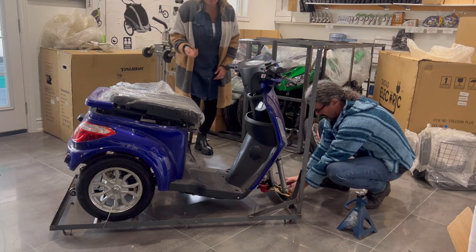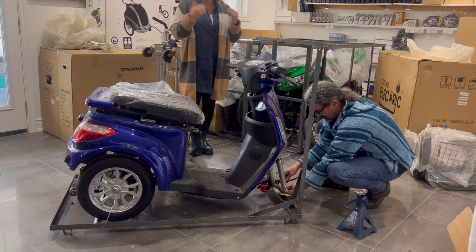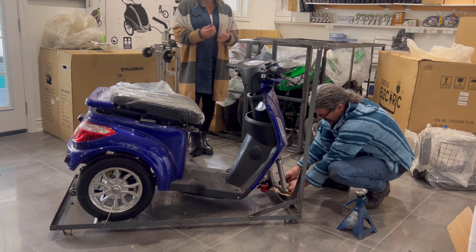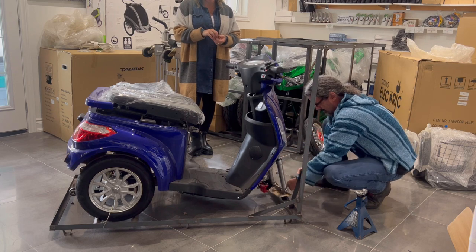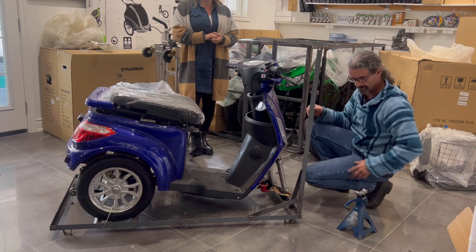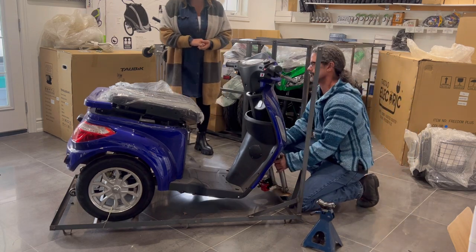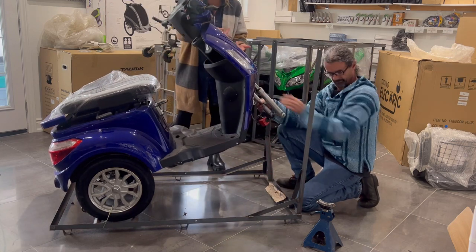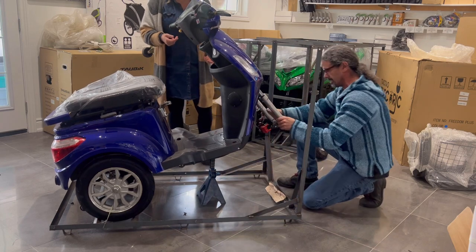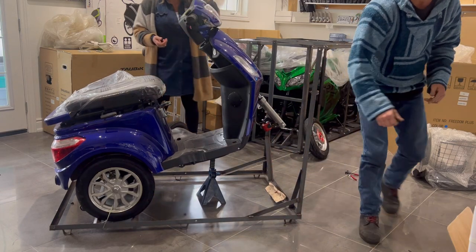This one is empty — this is how they come. If you order, we install the lithium or the lead acid battery and it ships to you with the batteries in, so you don't have to worry about that. The lead acid will have 60–75 pounds of battery in it. The lithium is about 22 pounds — it's a very light battery.